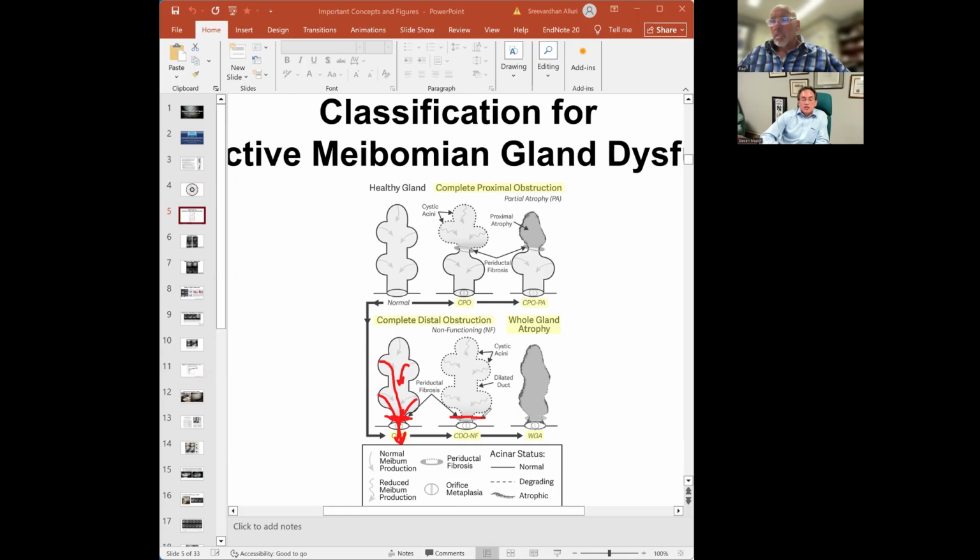and what happens is the pressure builds up inside of that gland, and if we don't release the scar tissue, then high pressure will ultimately, well, first it causes cystic changes in the acini. So the acini will develop the cystic deformity. Well, it'll bulge outward, and that's what we show in the middle image on the lower row. But ultimately, the gland will undergo atrophic change, and you can see the bottom right, whole gland atrophy, where there's atrophic change.